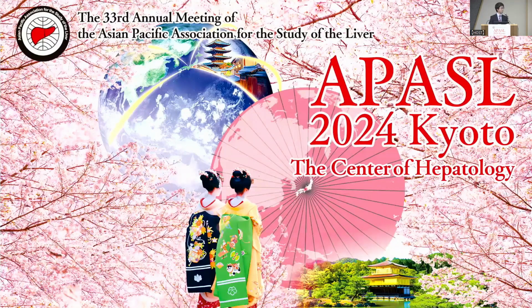It's my experience, but if an image is contaminated with some motion or significant artifacts, sometimes super resolution deep learning may make those artifacts stand out more significantly. So ugly images may not get improved in terms of image quality with the deep learning reconstruction. So what's your opinion regarding that?